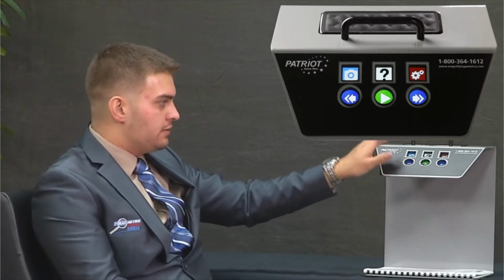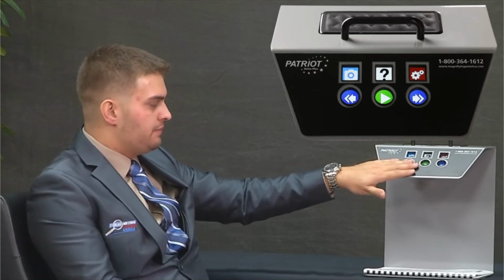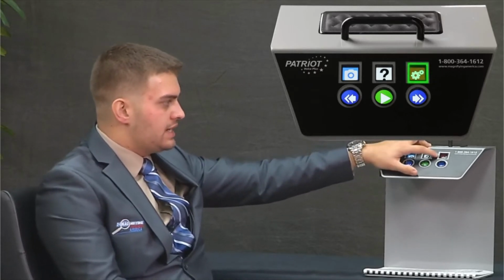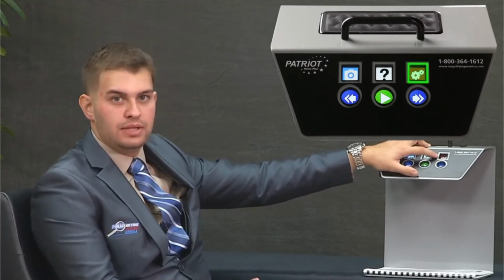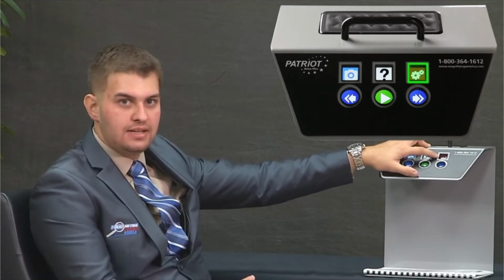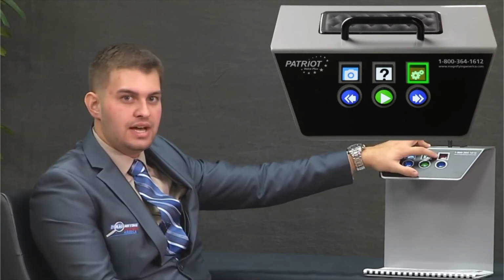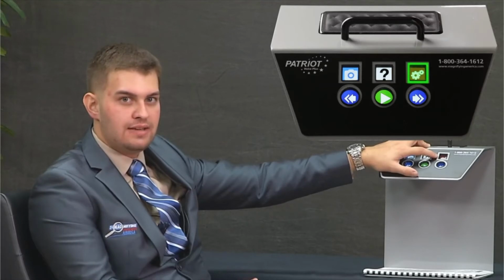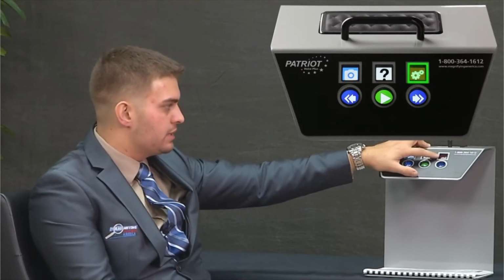So those 3, if you remember that, you've already narrowed down half the buttons on the machine by those bottom 3. The top right one is the settings. Most people will not have to get into that. That's to change the voice, volume, language, the rate at which it reads at. You could adjust all of that inside the settings. Once it's set though for the first time, you shouldn't have to change it again because it saves all of your settings even if you turn off and on the machine. So that's the settings right up there.